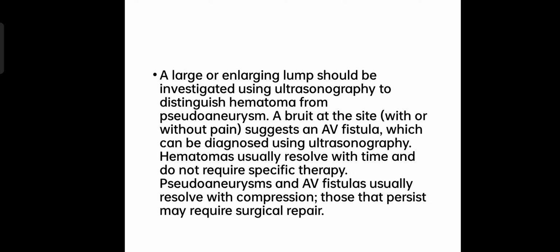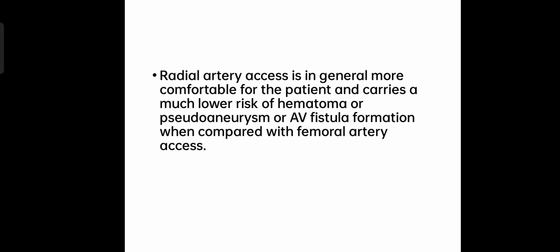Hematomas usually resolve with time and do not require specific therapy. Pseudoaneurysm and AV fistula usually resolve with compression. Those that persist may require surgical repair. Radial artery access is in general more comfortable for the patient and carries a much lower risk of hematoma, pseudoaneurysm, or AV fistula formation when compared with femoral artery access.